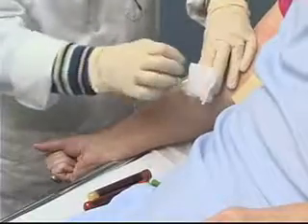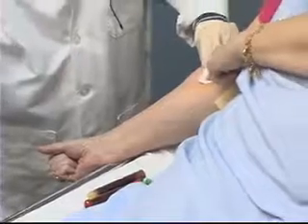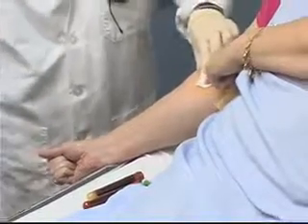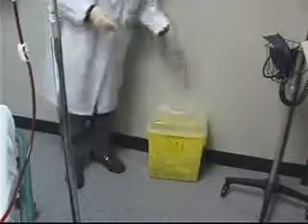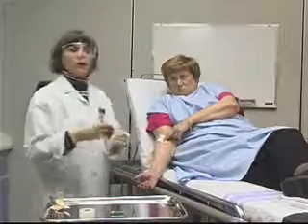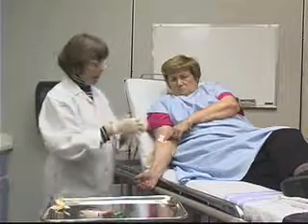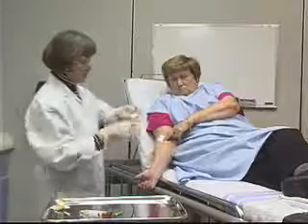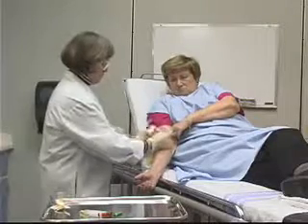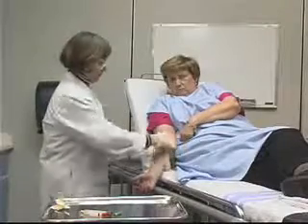I take my gauze, put it over the site, and very quickly pull the needle from the vein. I can ask my patient to please put some pressure there. I'm now going to dispose of the vacutainer and the needle without recapping the needle into the appropriate sharps container. I'm going to take my blood tubes, label and requisition them, and send them off to the lab. The last step is to come back to my patient and put a piece of tape over the gauze. And we're done.